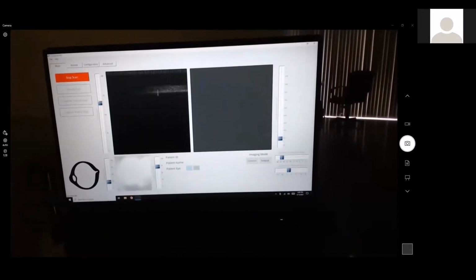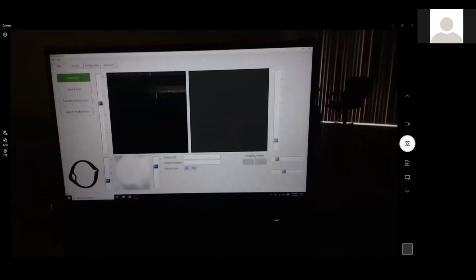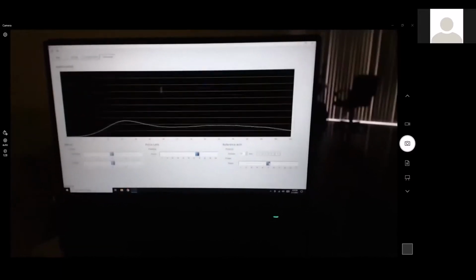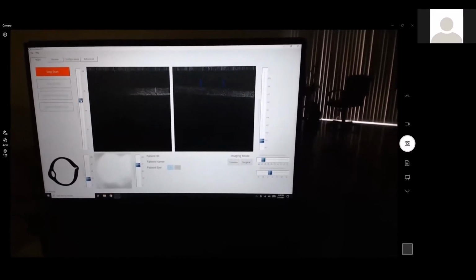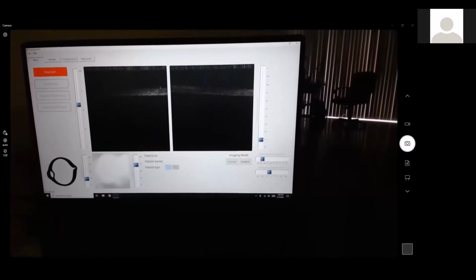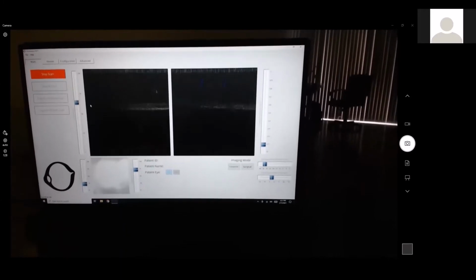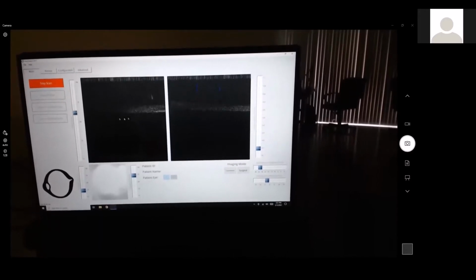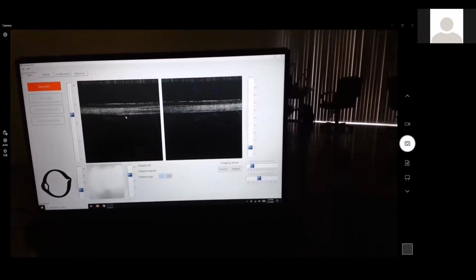Let's go back to cross again. It's okay? Yeah. There we are.